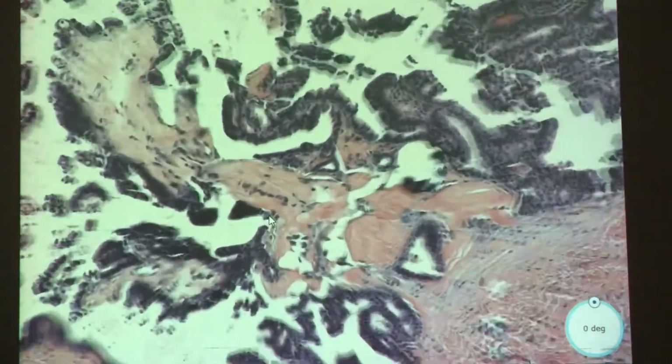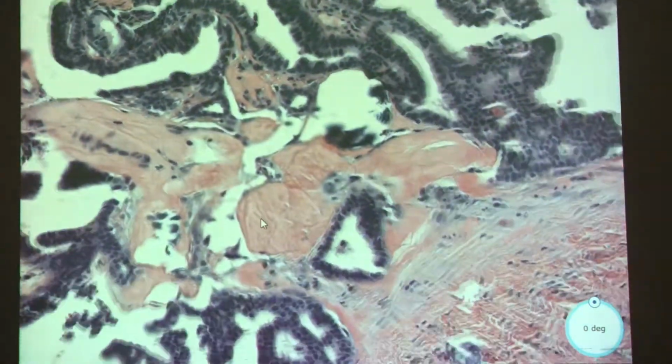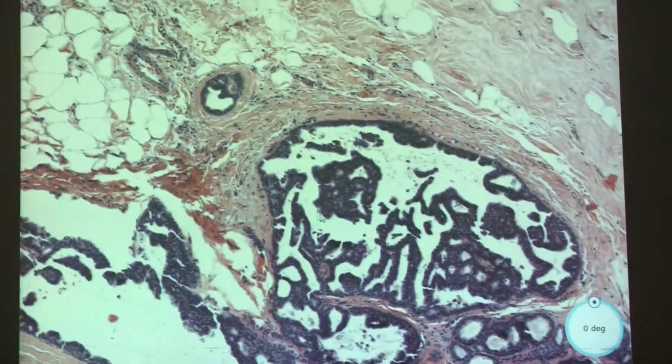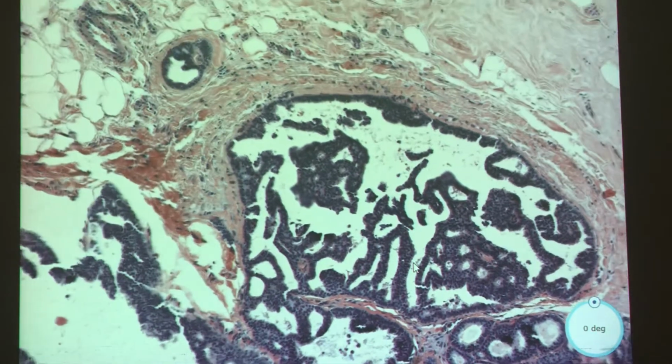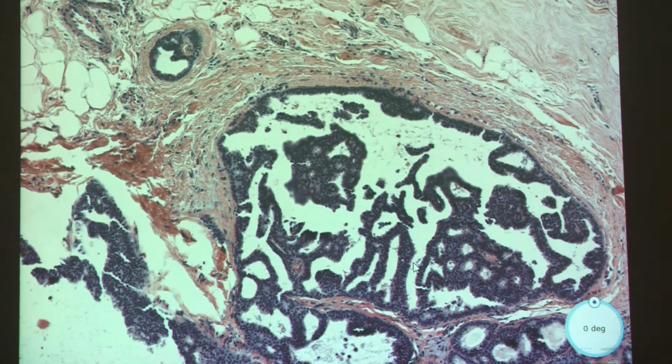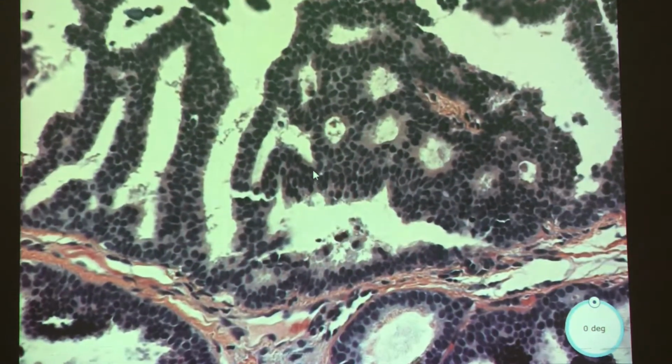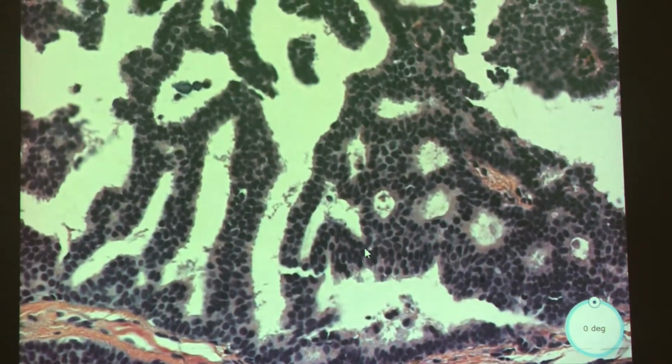Because you said it looked like ADH, so... Yeah, so probably low grade. Okay. It's not really having any necrosis, so it won't be a high grade like comedonecrosis. And the criteria, so it looks more normal, quote unquote normal, you know.